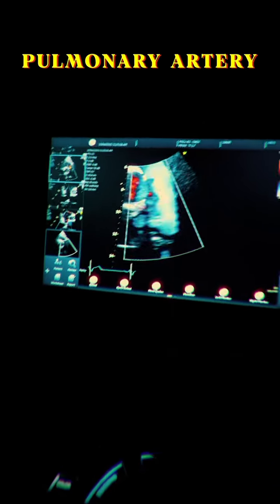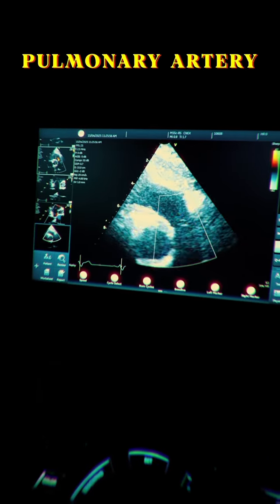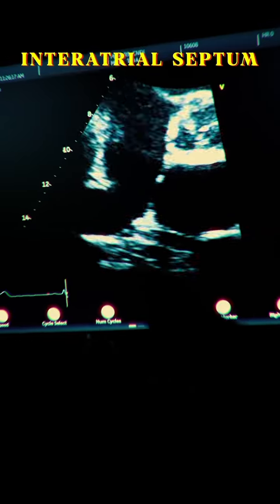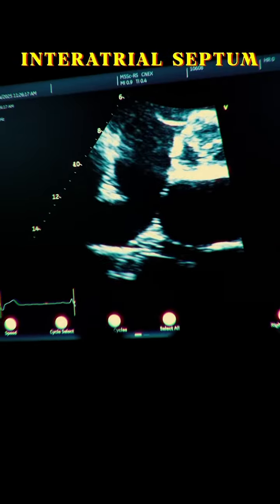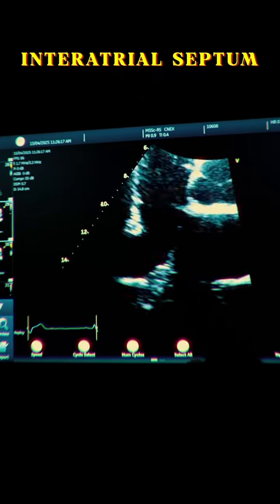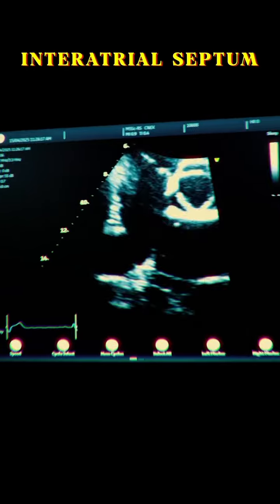And looking at our pulmonary arteries, we can see that the patient had trivial regurgitation, which is seen by this little red candle-like jet. Our interatrial septum was intact with no color sign of a PFO or ASD. Little side note, 1 in 4 people are born with this little hole in the heart, so it's important to make sure we check it in every single view.